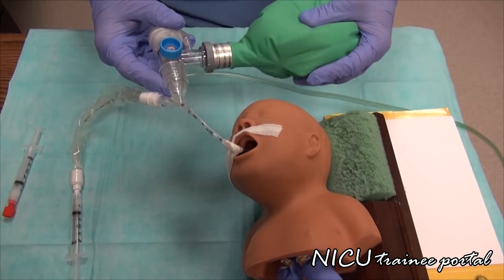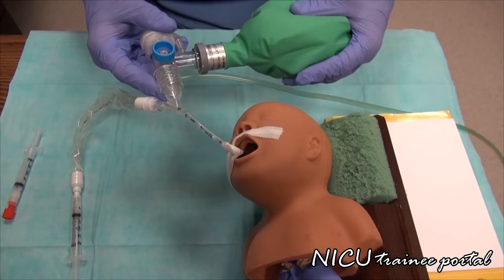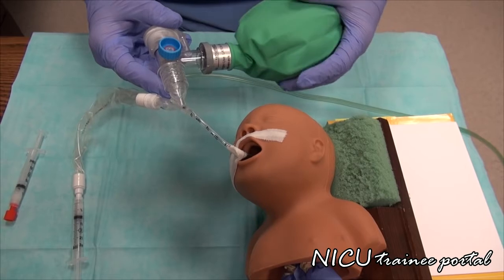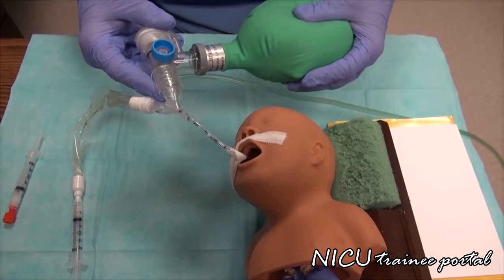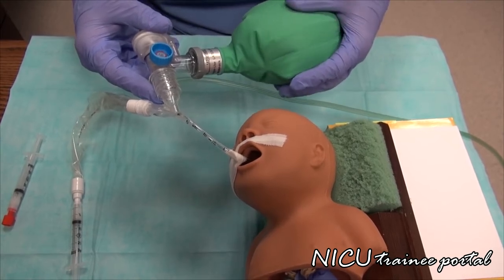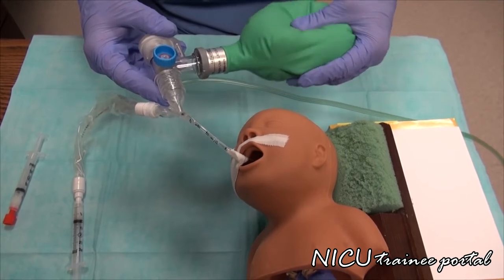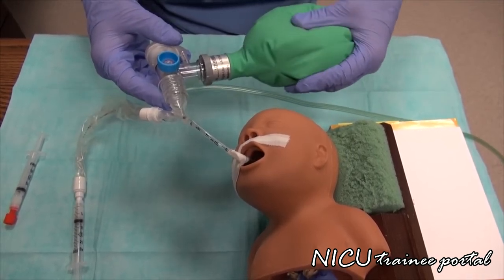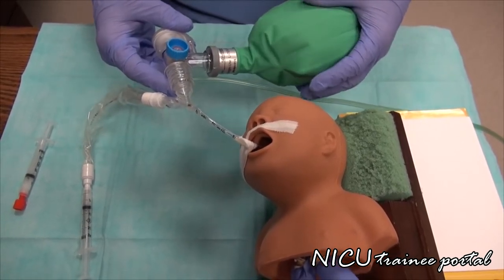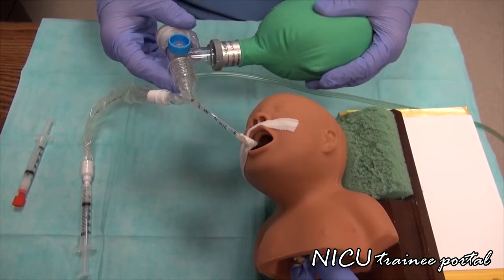So after removal of the catheter, like mentioned before, we want to bag at around a rate of 40 to 60 breaths per minute. And while on the right side here, we would want to bag between 1 to 2 minutes, making sure our vital signs are stable. And as we come to the end of our 1 to 2 minutes, and we have no remaining surfactant in the ET tube and our vital signs are stable, we will then return the baby back to his or her back or neutral position.